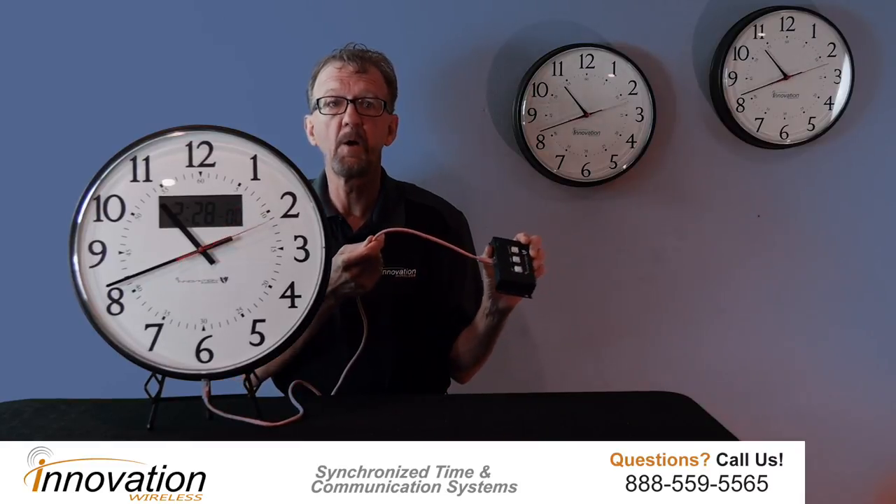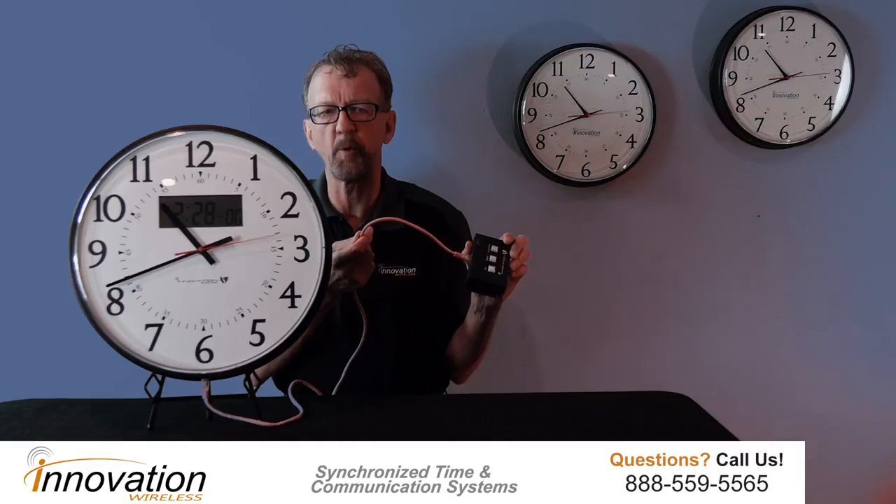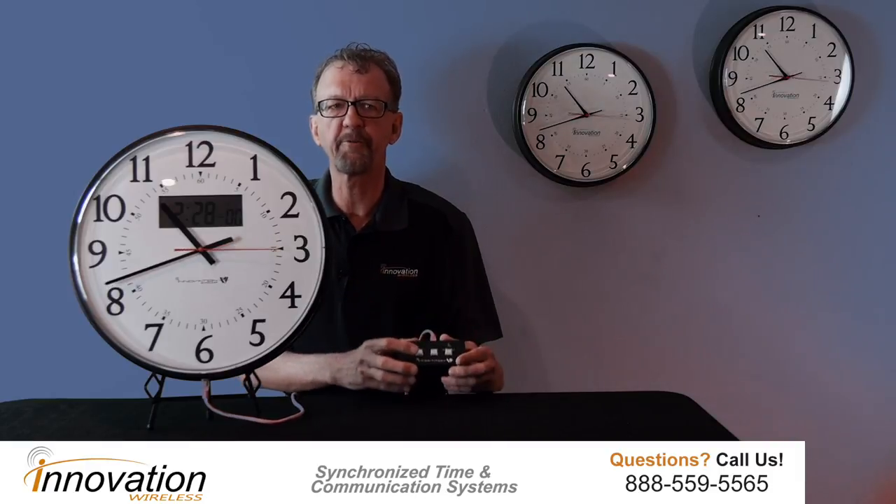The switch controller is separate from the actual clock and is tethered to the clock with a standard Ethernet patch cable. The controller has three buttons: set, stop and start, and reset.